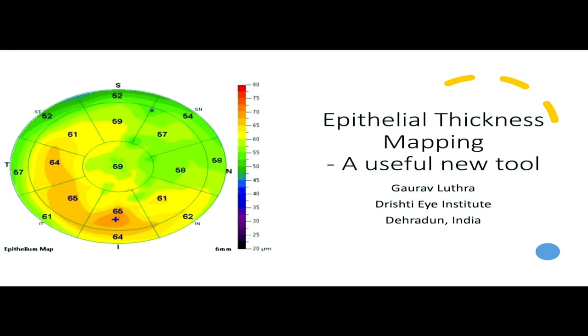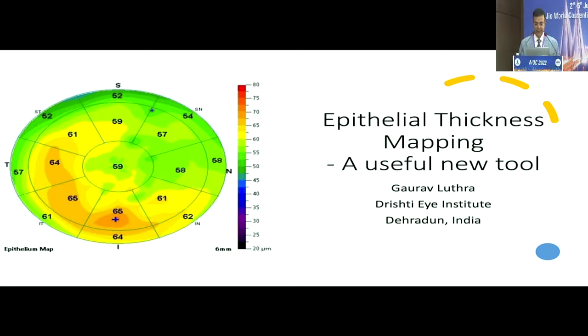Thank you, Dr. Chitra, and very good afternoon, everyone. I think it's a privilege to be in Dr. Chitra's course for the last couple of years. It's been very interesting. So, ma'am has asked me to speak on epithelial thickness mapping, which has been very close to my heart all these years. We started doing this about 6-7 years back, and ever since it's become almost as invaluable as a topographer or a Pentacam for our refractive surgery workups and follow-ups both.